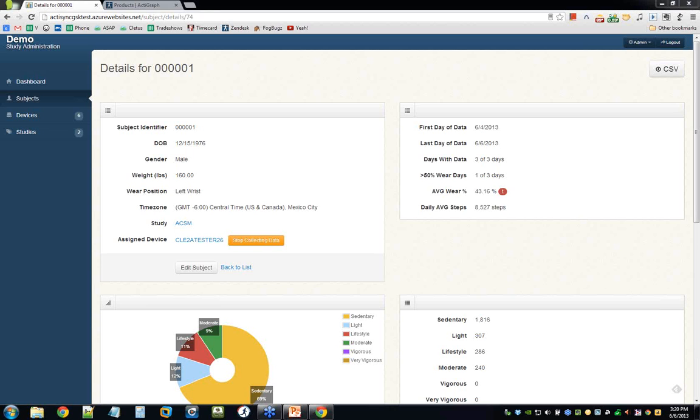Jameen asked if you can associate another device to the same subject just in case the unit gets broken. No, it's one device, one subject right now. Basically, if the unit dies or something happens to the device, then on their next visit, or if you detect it from their in-field uploads, you can send them a message and say, "Hey, we need to replace the unit." But right now it's just one device, one subject.